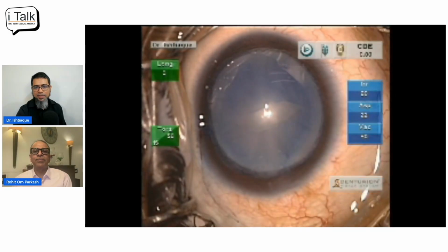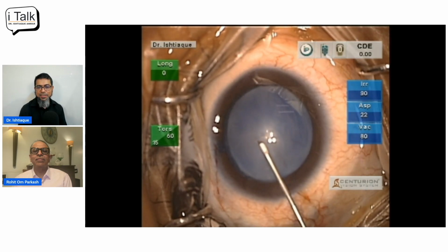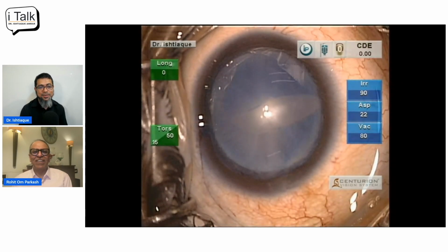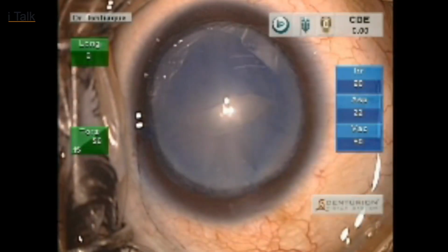Dr. Rohit, I'm going to share one of my videos. This is a video that I did many years back. This was a white cataract, and I just nicked it, but what I did wrong was I tried to increase it, and it just kept going. I gave high OVD. This was a very difficult position for the surgeon, because you just happen to start, and it ripples out and creates an Argentinian flag sign.